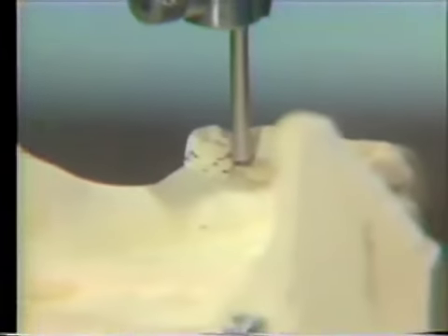So if we're going to use another indirect retainer, it will probably be in this mesial fossa of this abutment tooth. It would probably just be the mesial fossa of the primary abutment tooth. And I have the undercut marked in that area.